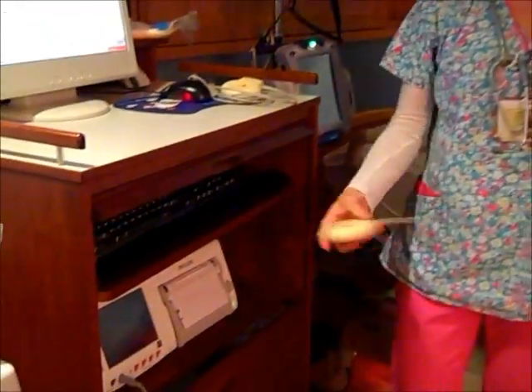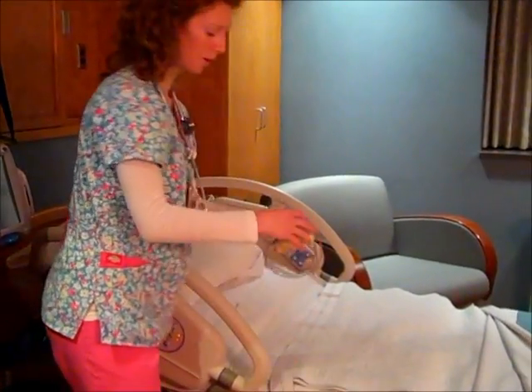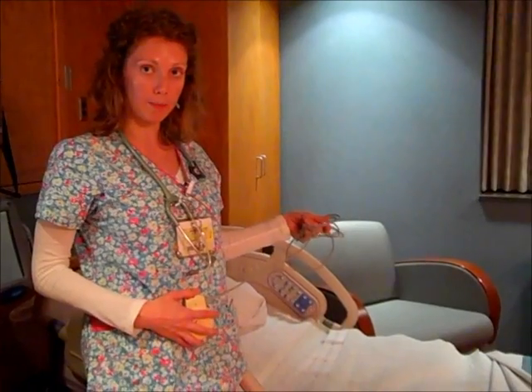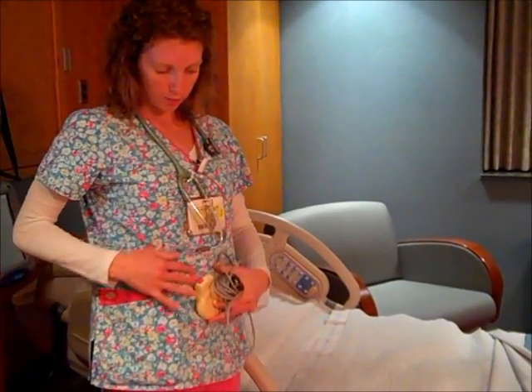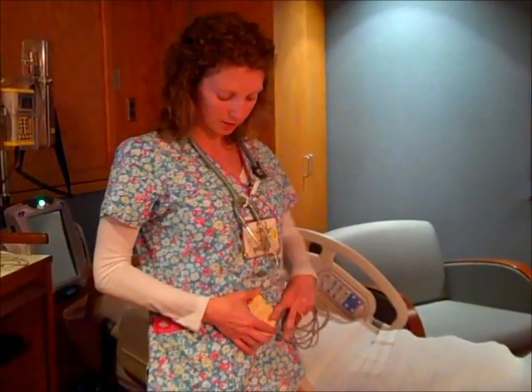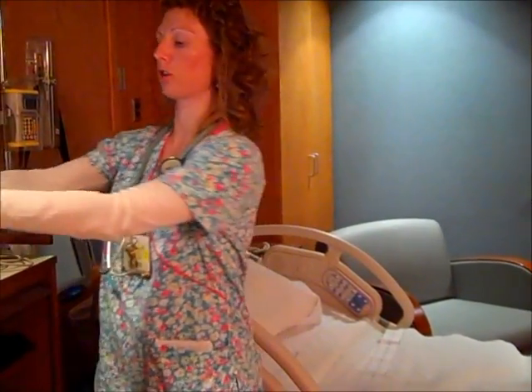So the TOCO transducer, commonly called the TOCO, is connected to the monitor here, and the patient will be positioned in the bed. They've got these little straps here so that you can attach them onto their gravid abdomen, and you will place this on top of the uterus, and you can feel between the abdomen and the uterus where the uterus starts. It's usually a hard muscular feeling, especially with a contraction. You'll place this on here and attach it. So this is the TOCO transducer, also called the TOCO.